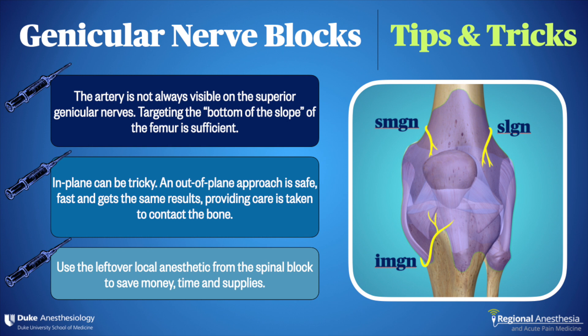Here are some things we've learned along the way. The artery is not always visible, but if you target the bone at the bottom of the slope that gets you in the right location. The in-plane technique can be challenging sometimes, and for that reason the out-of-plane approach is a great alternative — same probe position, same ultrasound image, just be sure to come down very steep to contact the bone at the same location. We've made this a zero-cost technique by using the remainder from the vial of half percent bupivacaine we've just used for the spinal block, and we use the same block syringe and needle we just used for the IPAC block. We want to maximize the effect of the block, so using a good dose of bupivacaine here makes sense.